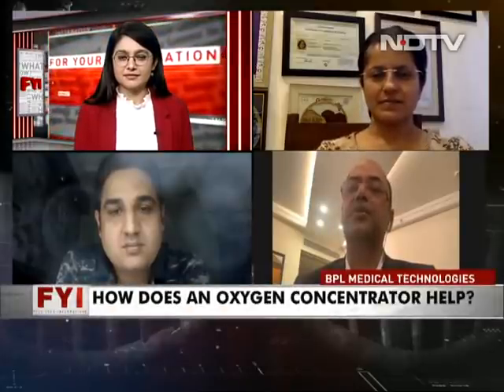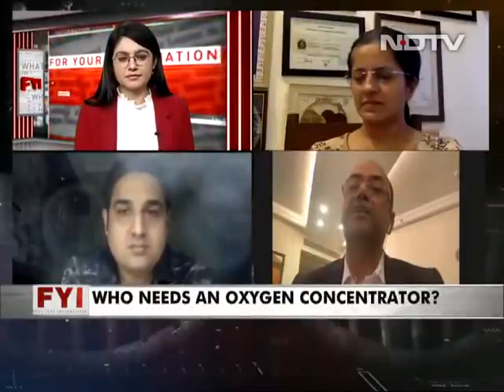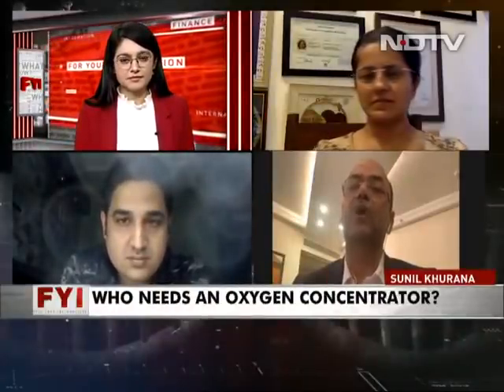Now, coming back to maintenance, there are two types of maintenance. The filter you can clean after 2 weeks, you can just take it to fresh water, put it under the tap water and it gets clean. But the most important is that you have a chemical here by the name zeolite. What zeolite does is that with the help of a compressor, you push compressed air through zeolite, and zeolite absorbs the impurity. So just think of your RO. RO has a candle, and over a period of time, you need to change that. Same thing happens for the zeolite also. When your purity comes down, it is not that the product has gone bad. You just have to change that particular candle, which is known as zeolite. So for moderate use, in about 2 years time, you probably have to change that.